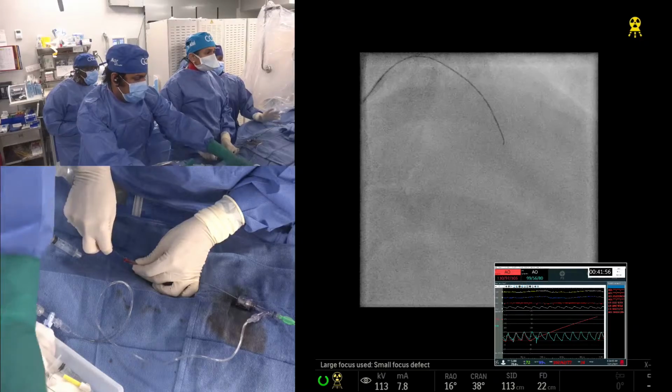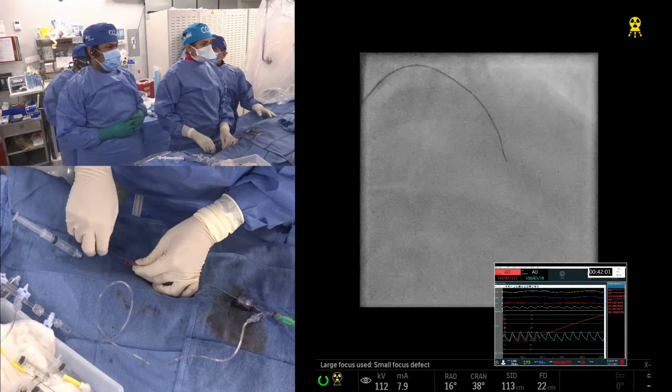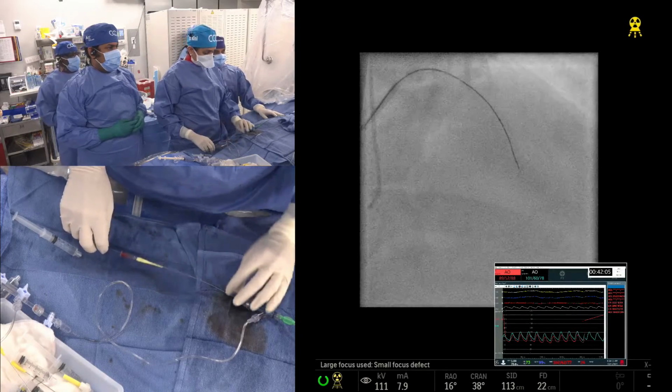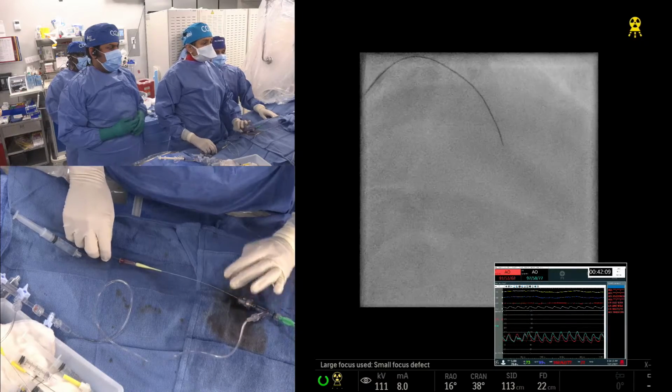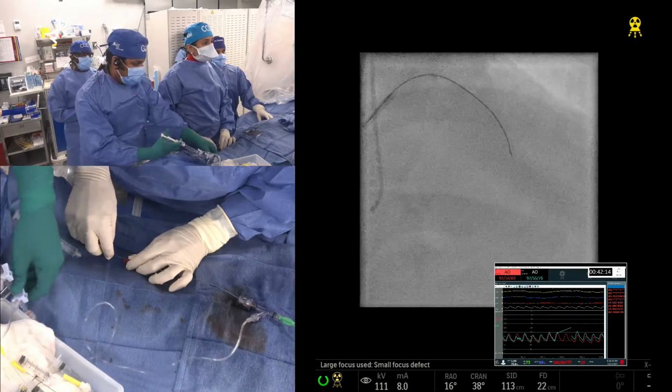Yes. Okay. If you want to take the vote, many people will go with the Gaia 3 now. I would have gone with the Gaia 3. AK likes the Miracle, being a hydrophobic tip. So Gaia versus Miracle, I think it's retrograde.